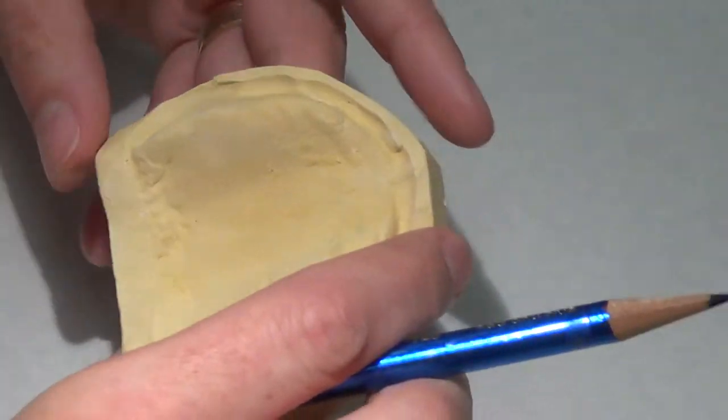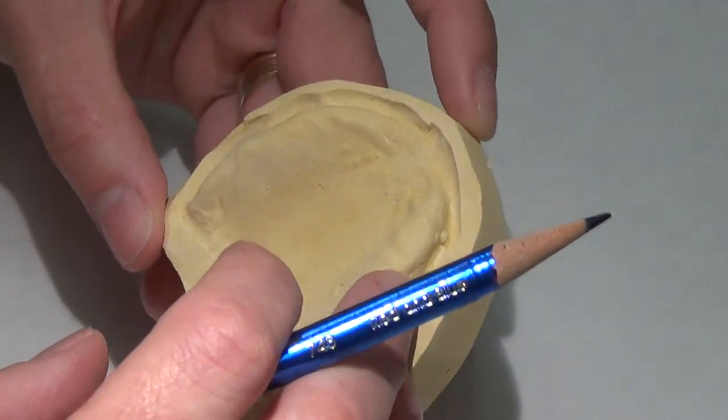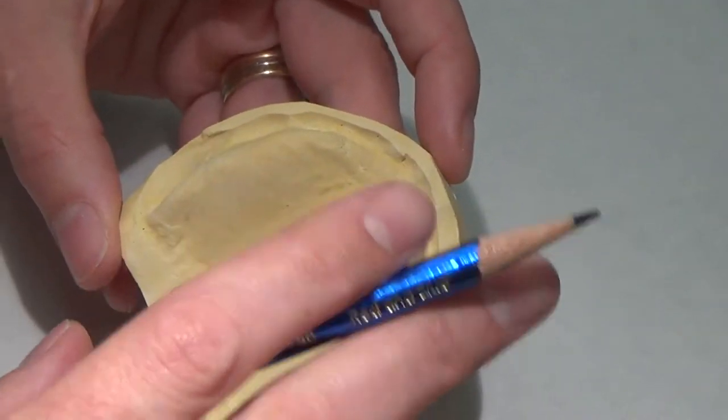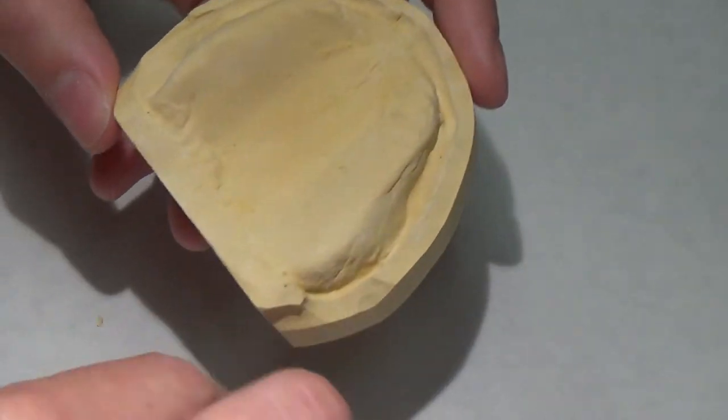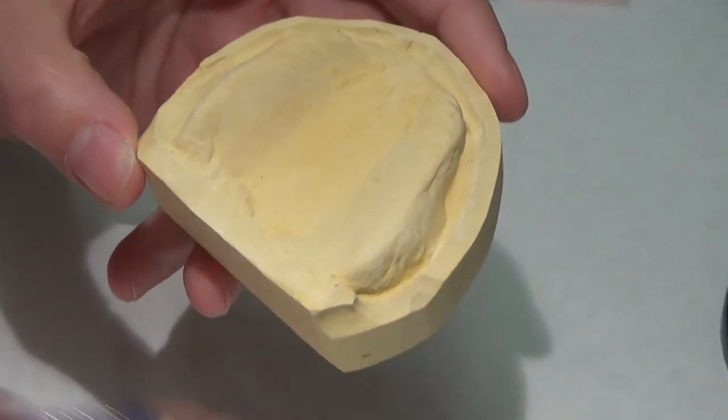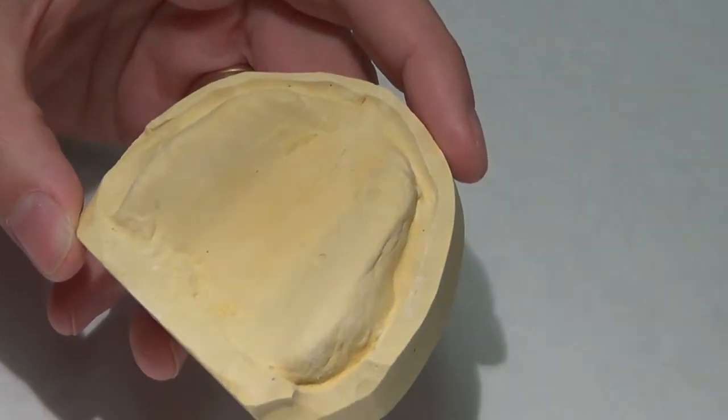On this patient who has severely resorbed ridges it's really important that I don't overextend this denture. So the best way I can describe this, if I've got a situation that looks like this for the remaining ridge versus one that looks like this.